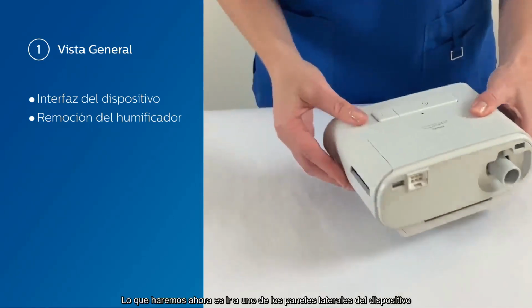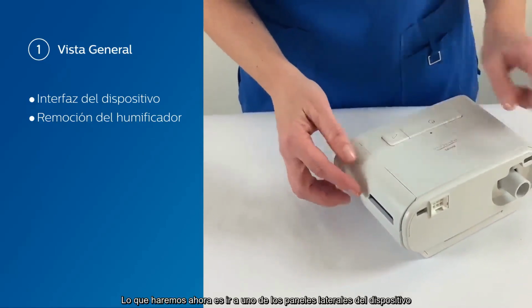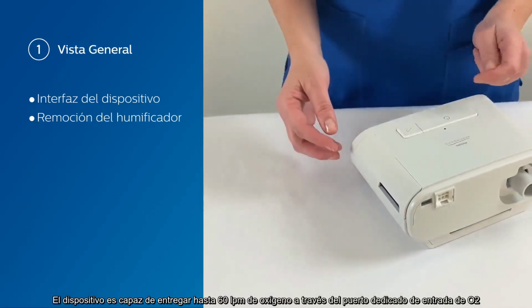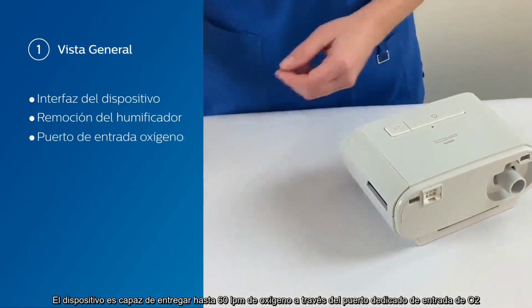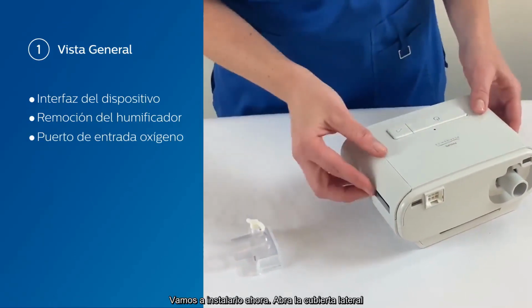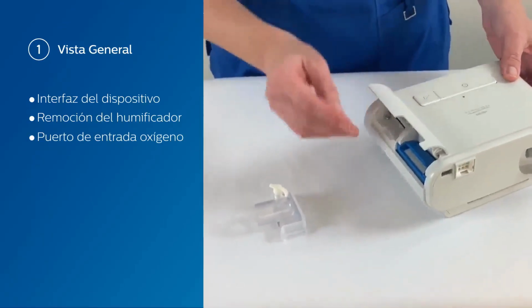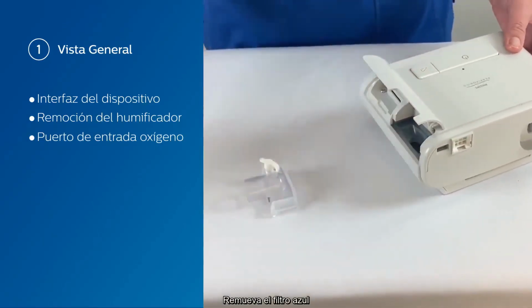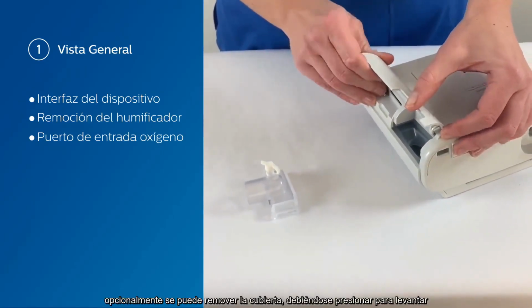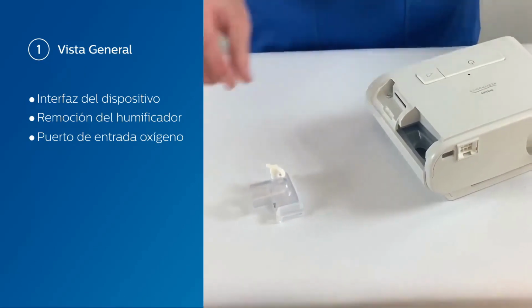What we're going to do now is actually go through one of the side panels here. The device is capable of delivering up to 60 liters of oxygen through a dedicated oxygen inlet port. We're going to install that now. Simply open the side door, remove the blue filter. It's optional to remove the door. All you have to do is pinch this and slightly lift up.